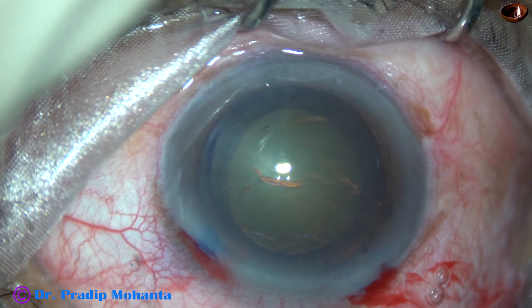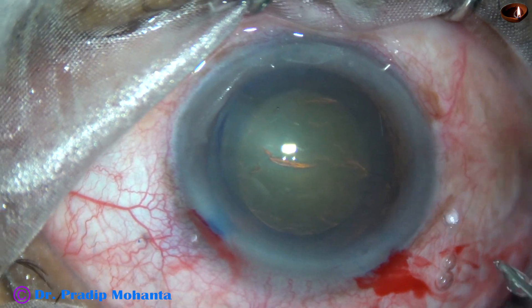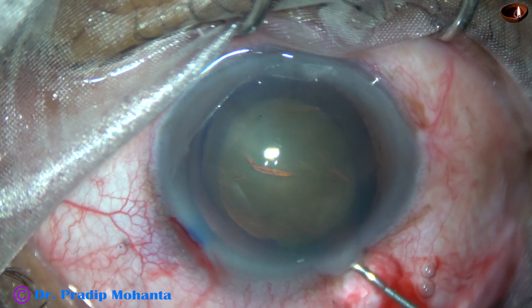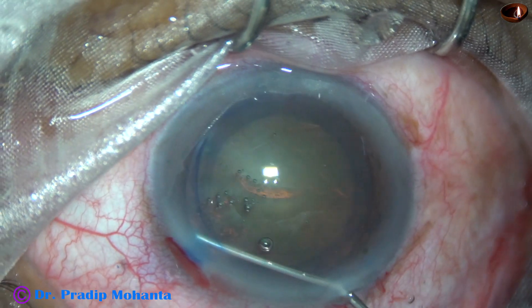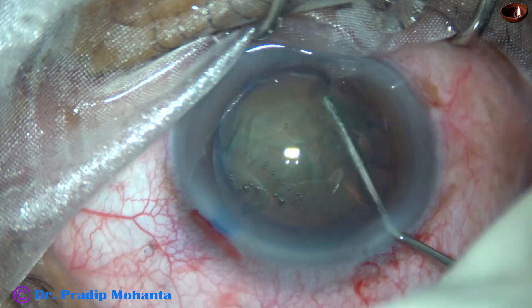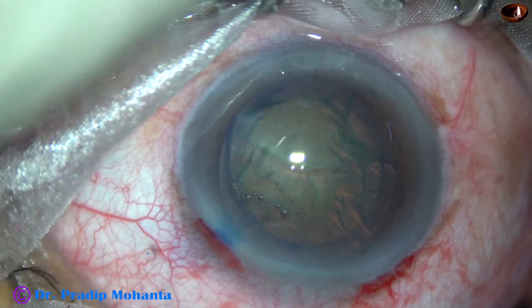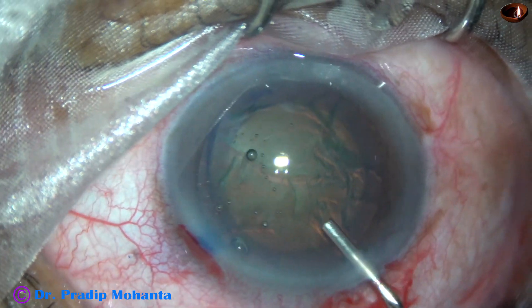This is an adequate size rhexis of about 5.5 mm. Hydrodissection is done with a 27-gauge cannula. The fluid wave goes to the other side, the nucleus is well-rotated and moves nicely. Visco is used to fill up the anterior chamber again.